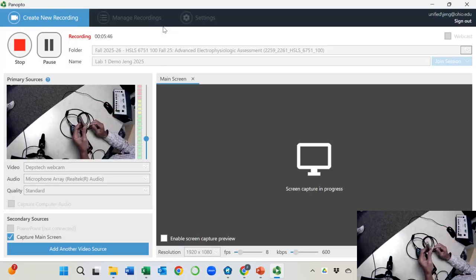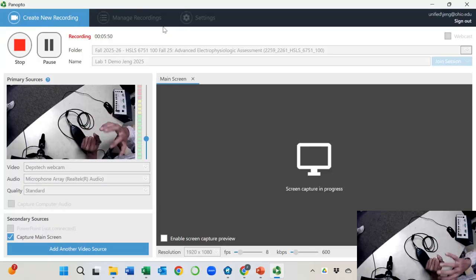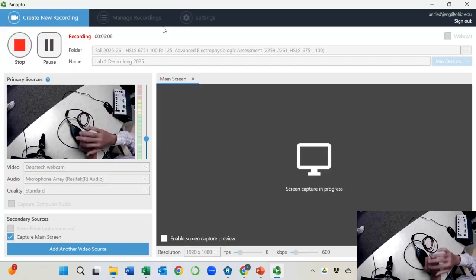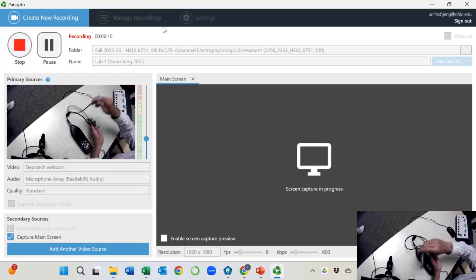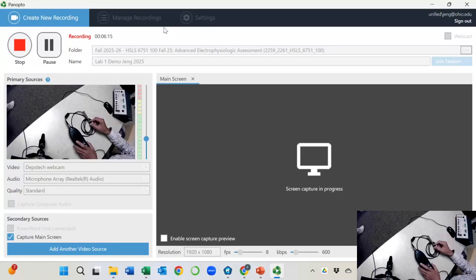But anyway, this is the microphone, and you see YouTubers have a big puffy protector, and I don't have that. So when I speak, I will speak away from the microphone, otherwise I will spit on it. It will be bad. Does that make sense? Because I don't have the protector here. But this is nice. You can connect it and move it to anywhere you want. Okay. And let's calibrate the insert earphone first.